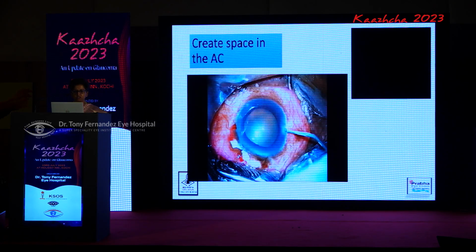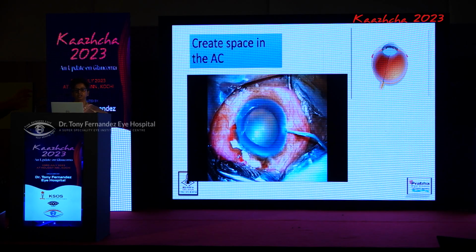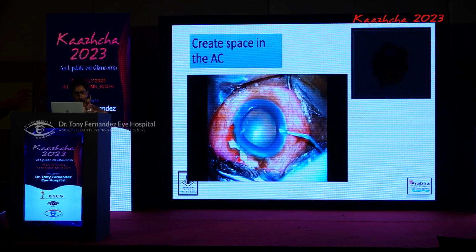The most important take-home message that I will give in this presentation of mine: in extremely shallow anterior chambers, when there is no space, you need to create space. And how do you do that? By putting a pars plana port.